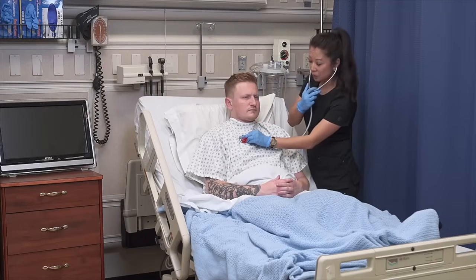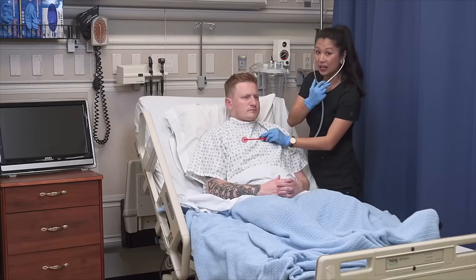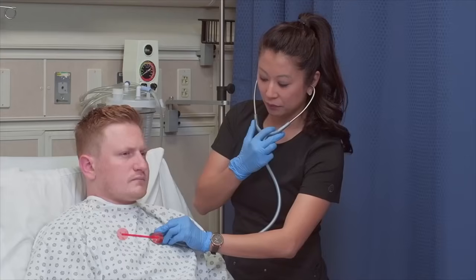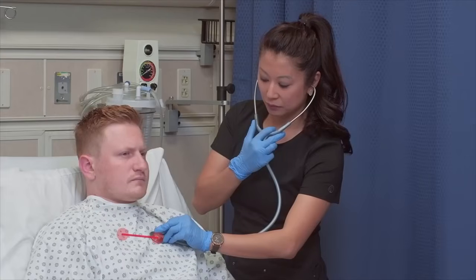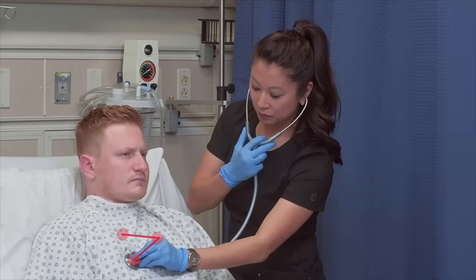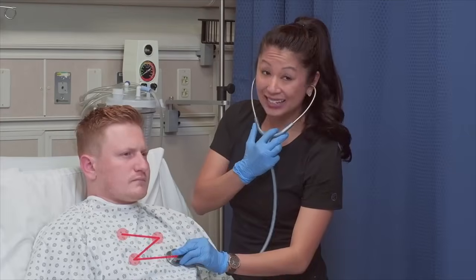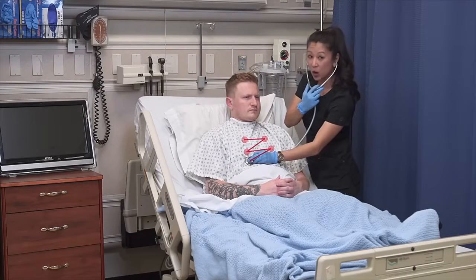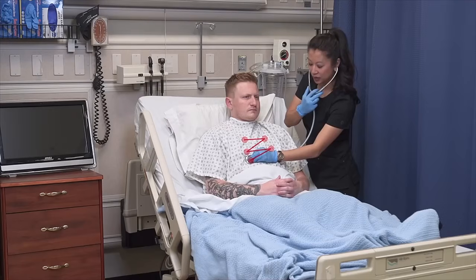Now, when I'm listening to Brandon, as you see, every inspiration and expiration is one breath. And again, I know I'm going over the clothes, but make sure you go skin to skin, so that way you don't pick up all of the sounds of Brandon's gown when you're listening.